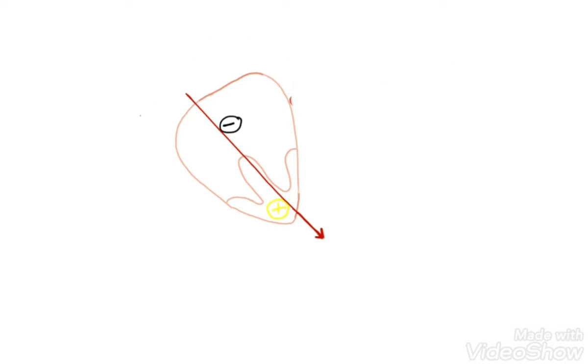Now electrodes are placed at a different location, and their axis is along the cardiac axis and very similar to it in sense of direction. Therefore, the voltage generated in the ECG will be higher than the previous.